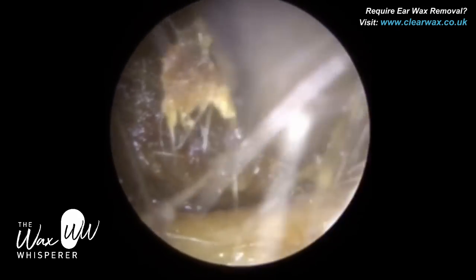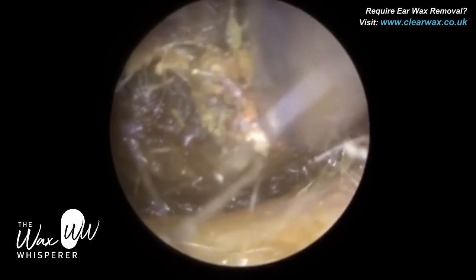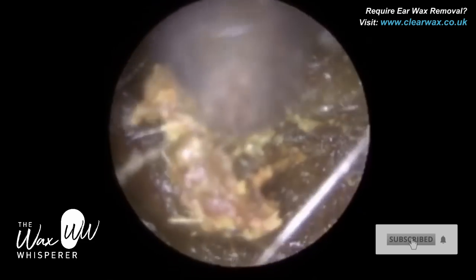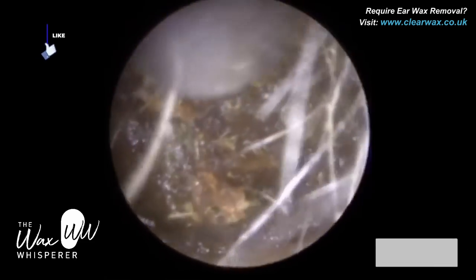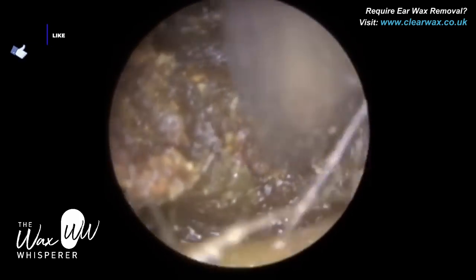We're near the entrance, quite lateral, and we know that because of all the hair strands. The hair follicles in the ear are located on the outer third — the cartilaginous portion. That's where the hair follicles are. The inner two thirds of the ear canal is bone-bearing, with a very thin layer of skin less than 0.1 millimeters in thickness, and there are no hair follicles there.